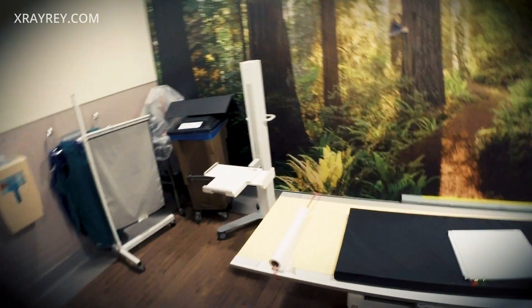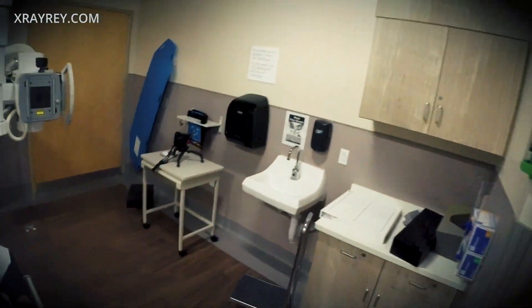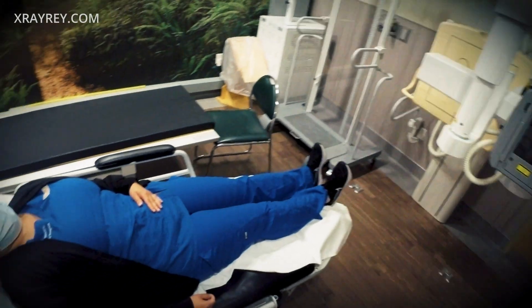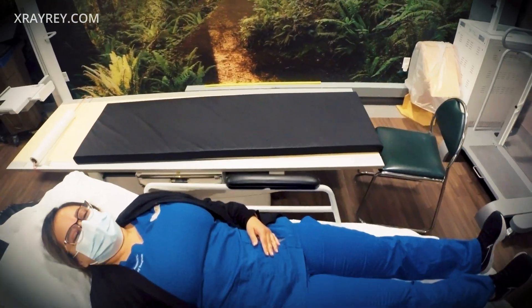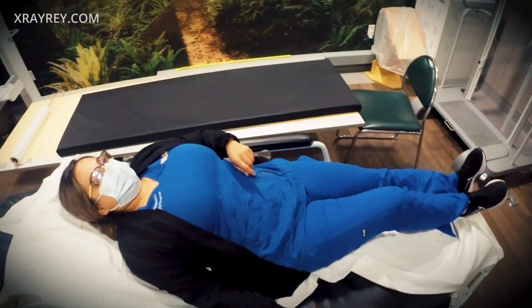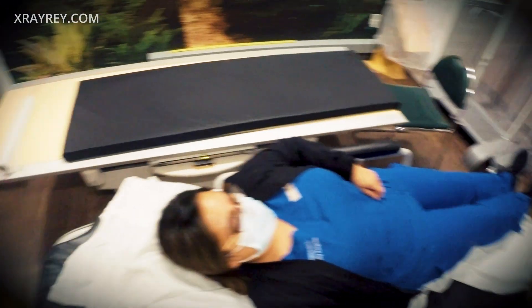What happened? I was at the club. Oh, at the club — and you fell? You slipped? Oh no, I caught my fall. Okay, all right. So first, let's look — are you able to scoot over to your left a little bit more? All right, good. I'm gonna put this board under you here, okay.